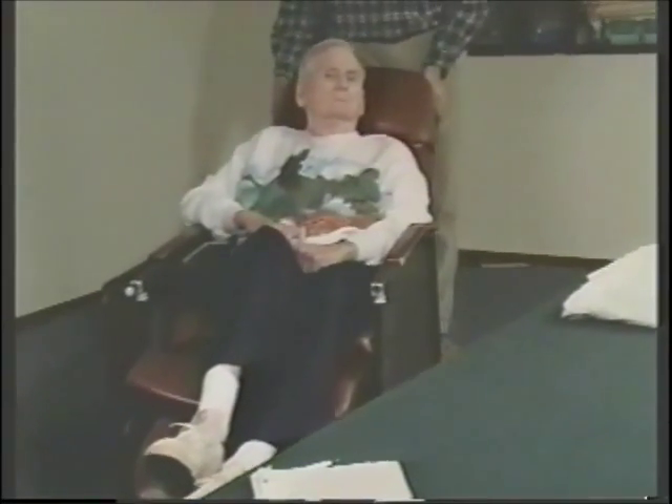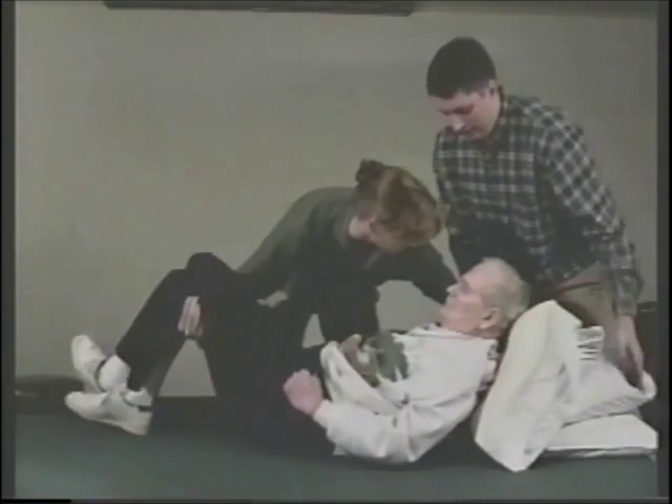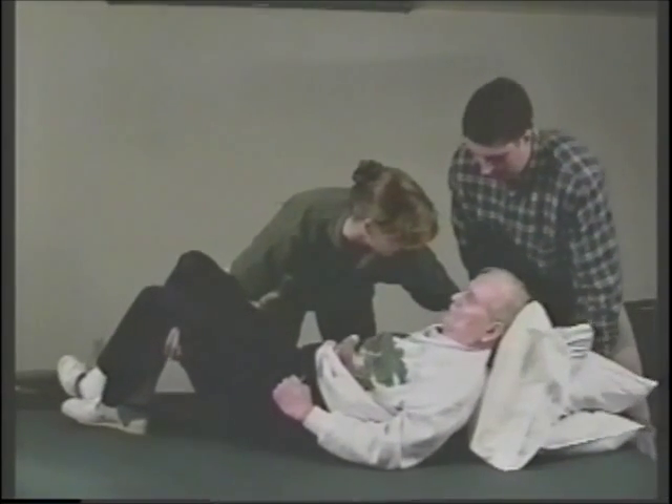Our next client is Jim. Because of Jim's breathing difficulties, we will not be taking the pillows out and having him lay completely flat on the mat.